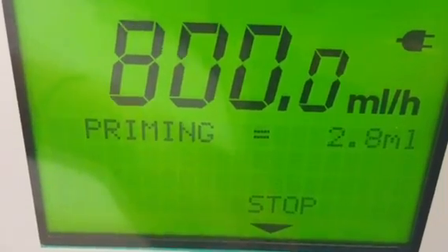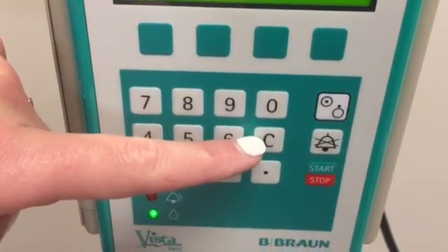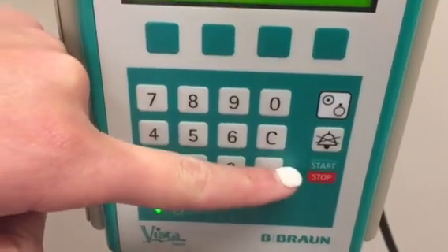You'll see here on your keypad you have your numbers. C is for clear or change, depending on what screen you're on. You also have your power button, your silence, and your start and stop.